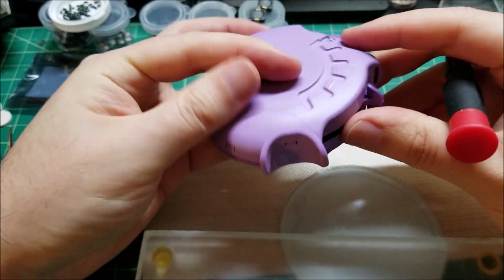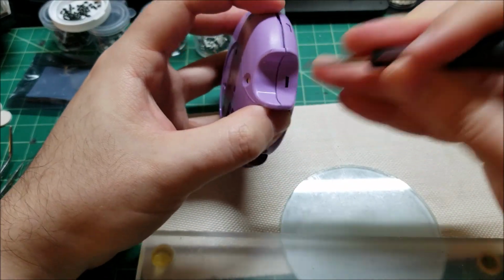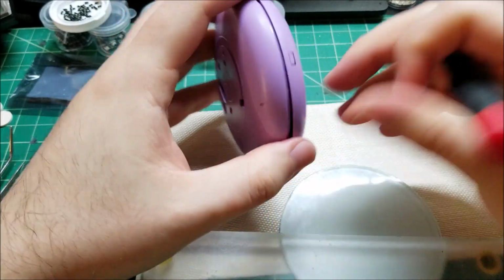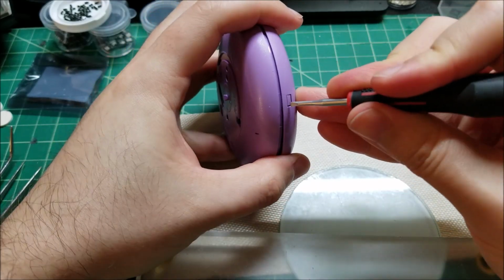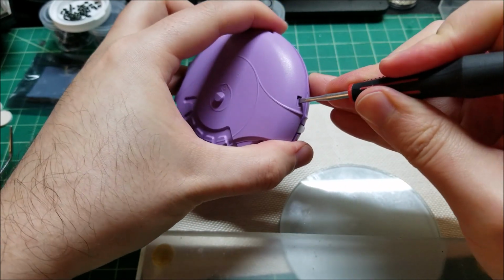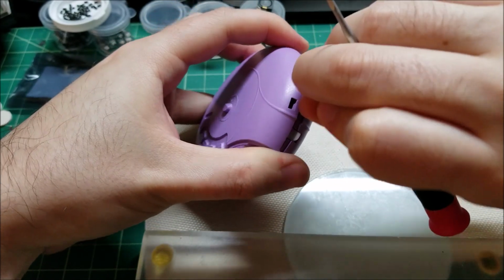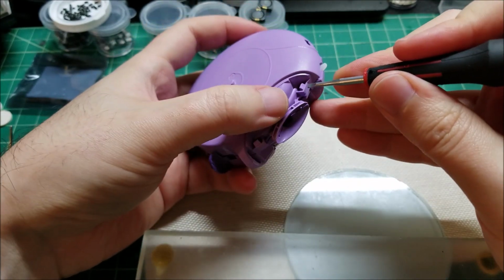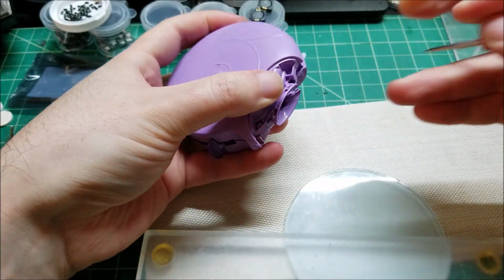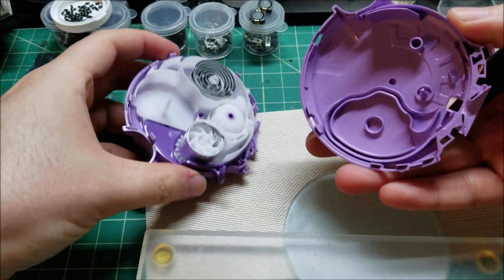But to get further into this, there are a couple catches. We're just going to press in on them and hold the case separated enough until it starts popping out. There are 2 catches on the inside here. I don't know why I'm doing this like a teardown. No one's really going to be tearing these down. I just wanted to know what was inside.